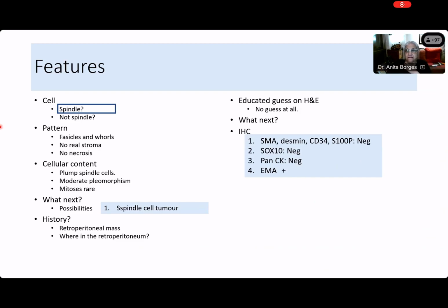Come on. No, ma'am. Why? Just based off this information. Not based on this information. But do you want to do the synovial sarcoma markers? No, ma'am. Why? Because there is pleomorphism. Kedar, if there is any pleomorphism at all, you do not want to think of a synovial sarcoma, right? So should we rule out a synovial sarcoma? No. It could be, but it's very unlikely because of the pleomorphism.